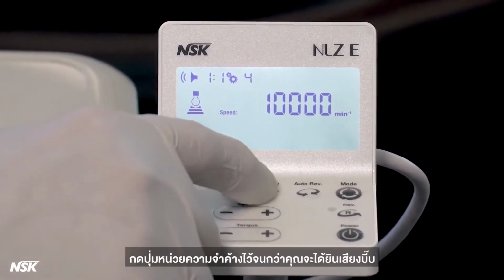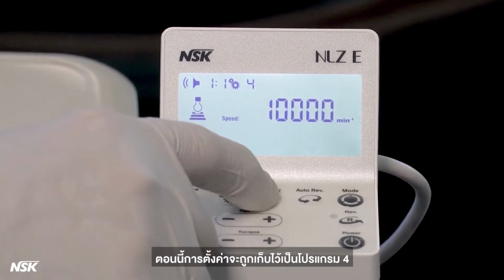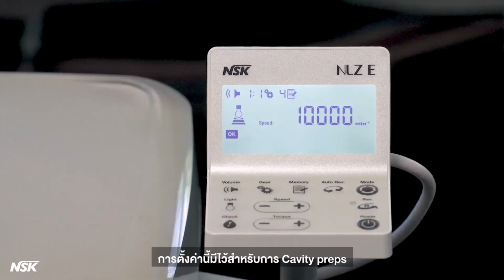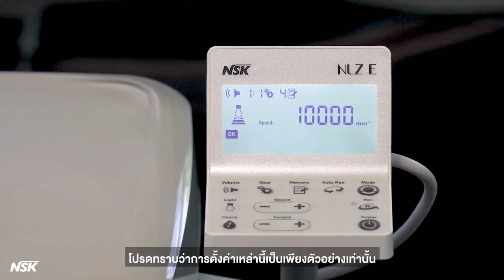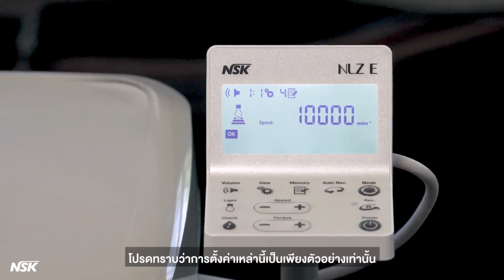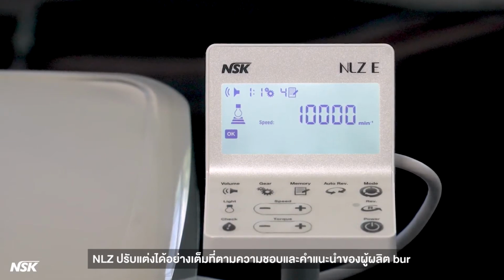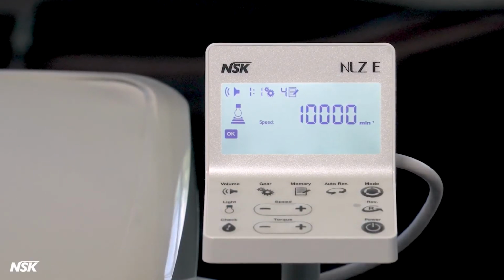Press and hold the memory button until you hear a beep. Now the setting is stored as program number 4. This setting is for cavity preps. Keep in mind, these settings are just examples. NLZ is fully customizable to your own preferences and recommendations by your burr manufacturer.